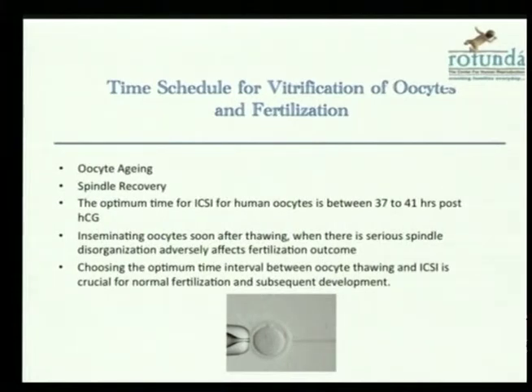We usually perform oocyte retrieval at 35 hours post-HCG. Vitrification of oocytes is performed at 2 hours after oocyte retrieval. ICSI is performed at 3 hours after thawing. So this is about 40 hours post-HCG.